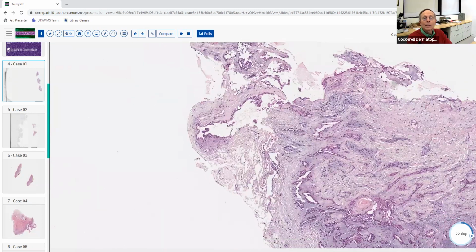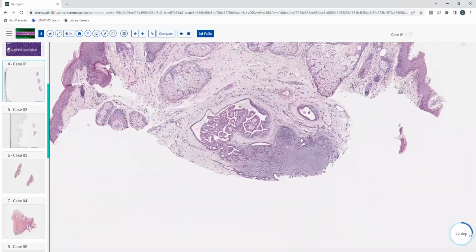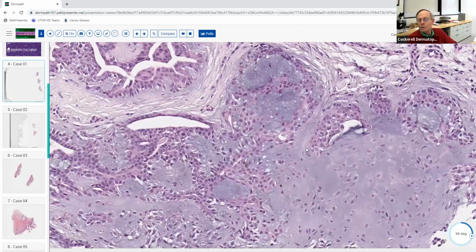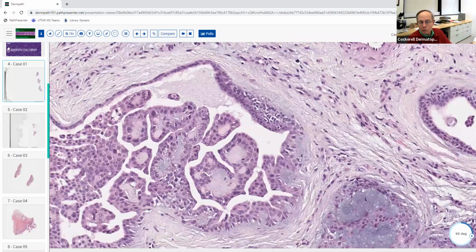And then if you go back to the other one, that's the other thing about this, by the way. These things, if you read the textbooks, they give you the classic descriptions and you look at it and say, wow, that's great. I've memorized that. And you'll live happily ever after. But if you start actually looking at some of these lesions under the microscope, occasionally you'll find that they don't read the textbook all the time. They have some unusual morphologies.